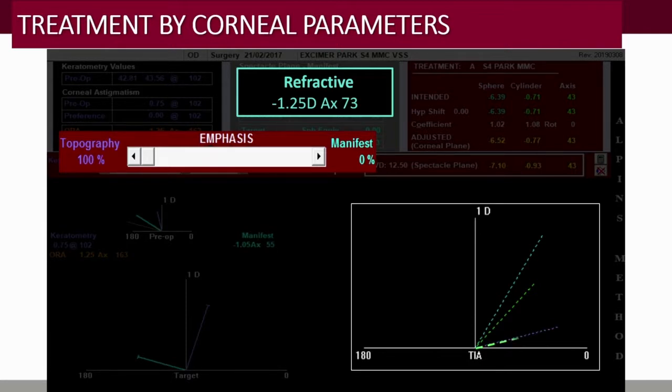And this is why, when you do a refractive surprise calculation, the calculation that tells you to rotate it, let's say, in a clockwise sense by 15 degrees, doesn't always take you to the steepest corneal meridian. In other words, I hear people saying, oh, I just re-rotated at the steepest meridian. Well, you won't get the best result that way. You need to rotate to the calculation you can get with those toric analytic calculators, and there's one on the ISRS website that I've built for the ISRS for free to use.